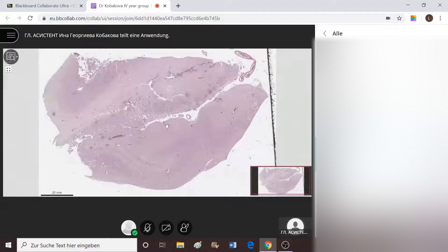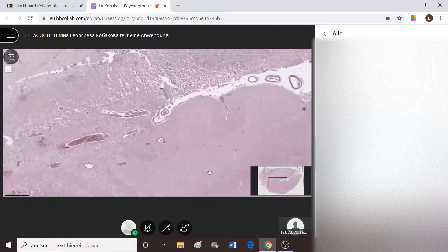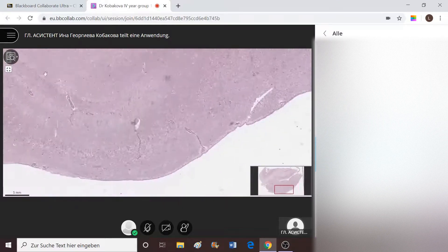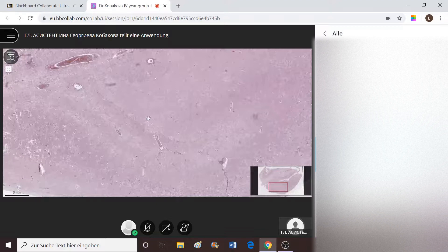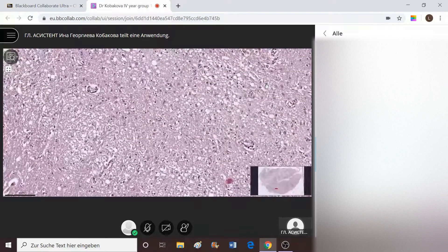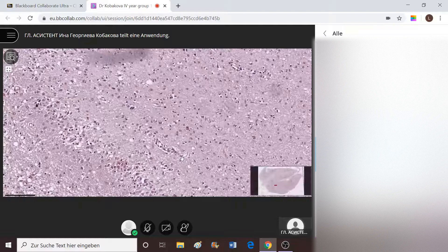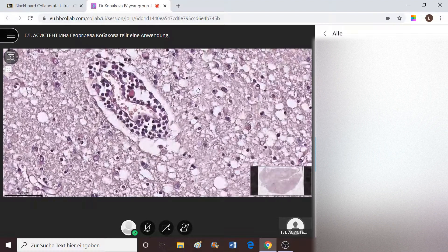Speaking about encephalitis, first of course we should see central nervous system tissue, which is well observable here. We have neurons, oligodendrocytes, and of course vessels. There's something wrong with the vessels because I see that there is infiltrate around these vessels, and if we take a look at it closer we may see that this infiltrate appears more like lymphocytic.